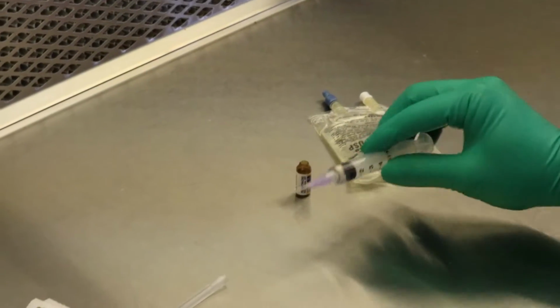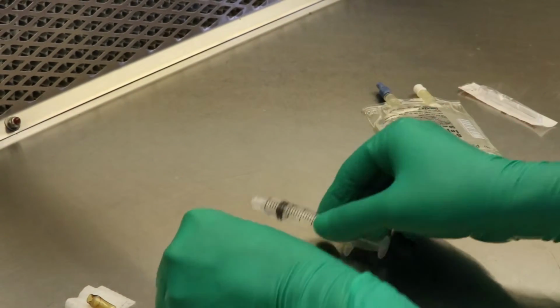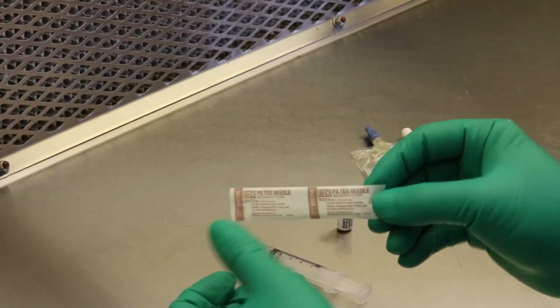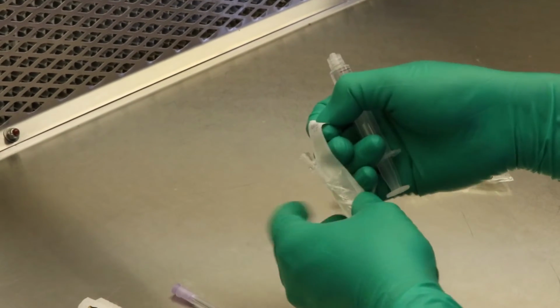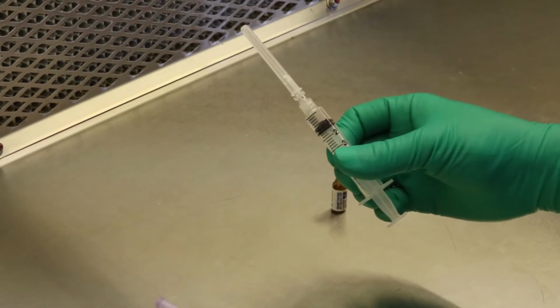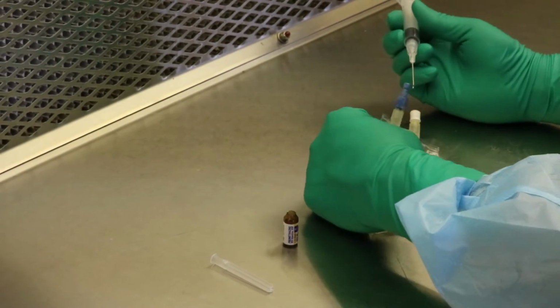Although you cannot visually see it, there may be small shards of glass in the solution, so it is important that you use a filter needle when injecting into the IV bag. Remember, if you use a regular needle to draw up the solution, you want to switch to a filter needle. Or if you use a filter needle to draw up the solution, switch to a regular needle. Do not use the same needle twice.